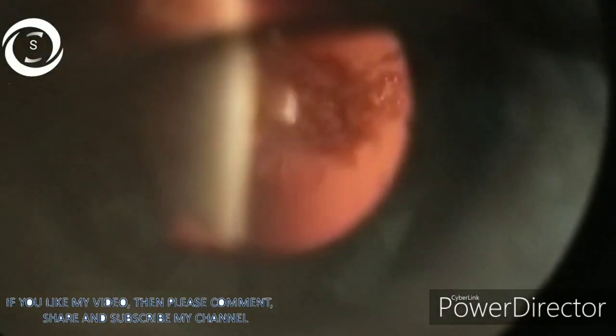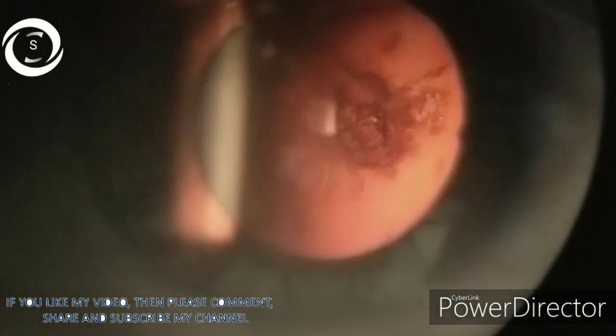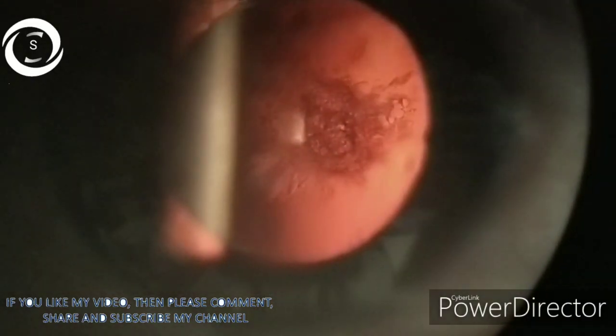Now look at this another patient with an insect-like appearance on retro illumination — it's also a case of posterior subcapsular cataract, and it is well delineated by retro illumination. It's a simple and easy technique to master and can provide very valuable information regarding pathologies and the shapes of the cataracts.